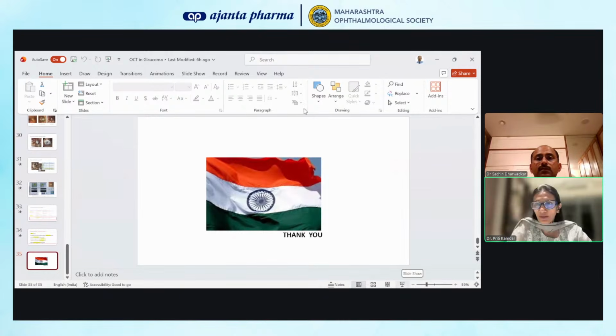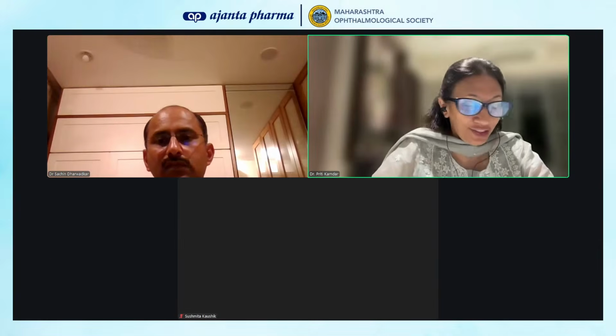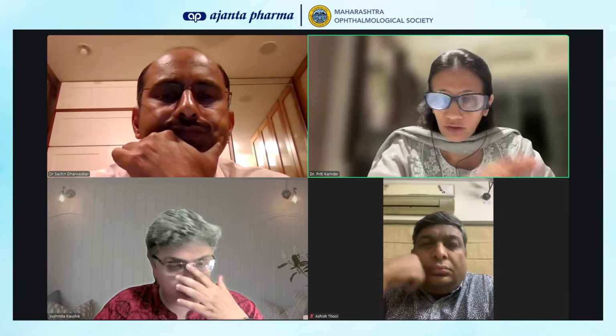So now let's go to the questions. That was a very in-depth lecture, but questions are always something which stimulates discussion, and discussion is what gives rise to learning. So the first question is on macular ganglion cell analysis and its importance. Dr. Sushmita, I'll direct the question to you. Dr. Sachin has said that he always does ganglion cell and the RNFL together.